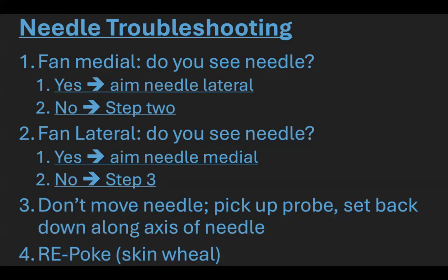And one other thing that I think learners are always afraid to do is re-poking. I've found sometimes they just whiff the first poke for whatever reason, and I think sometimes re-poking can be really helpful. That's another big benefit of doing a skin wheel. I don't know what y'all are doing, but I've done more skin wheels over time, because if the resident whiffs their first poke, it's a lot easier to re-poke, so you don't feel bad about re-poking the person if you anesthetize the skin.